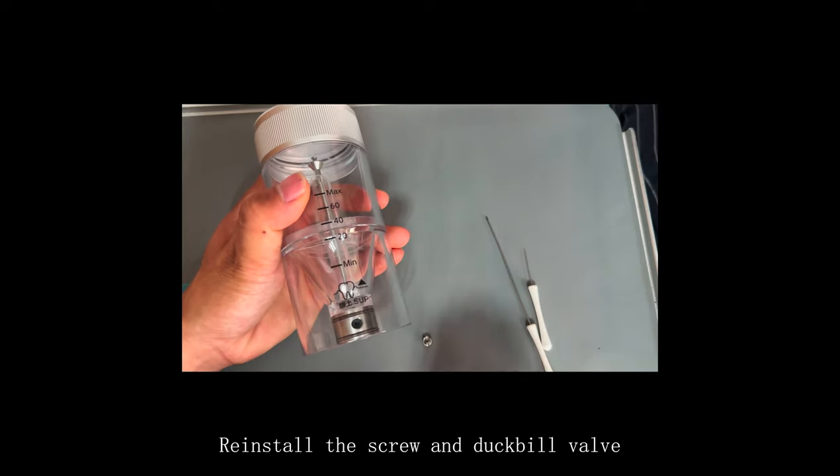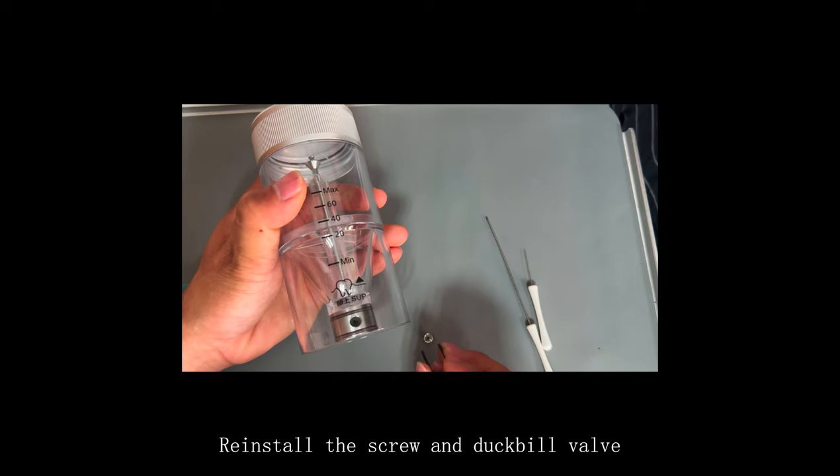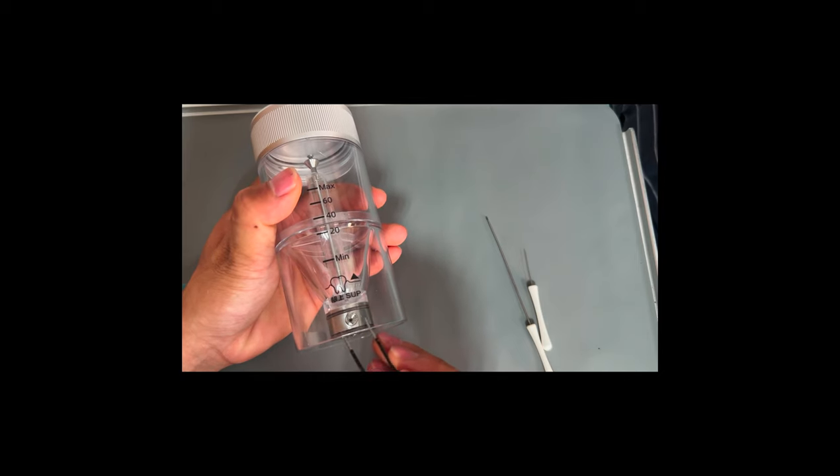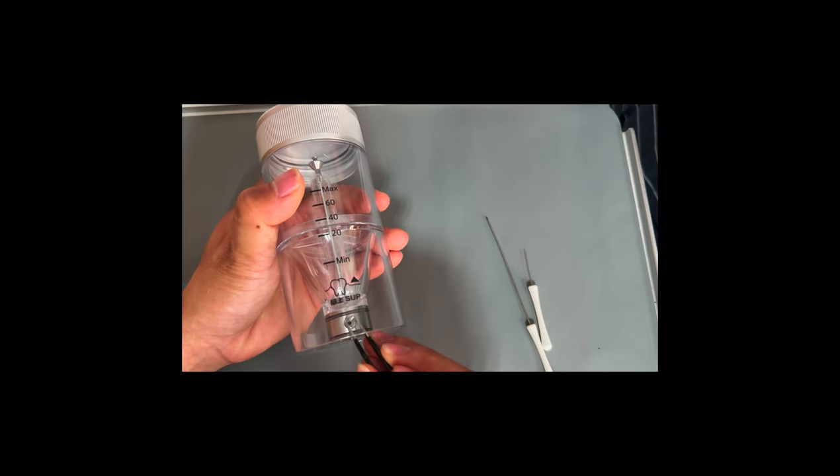Reinstall the screw and duck-bill valve.